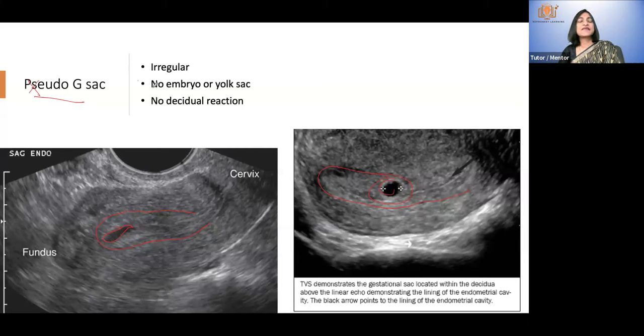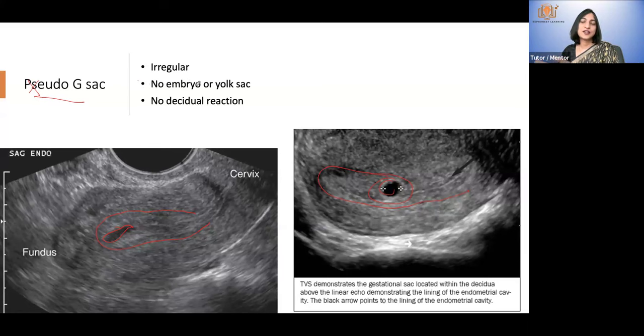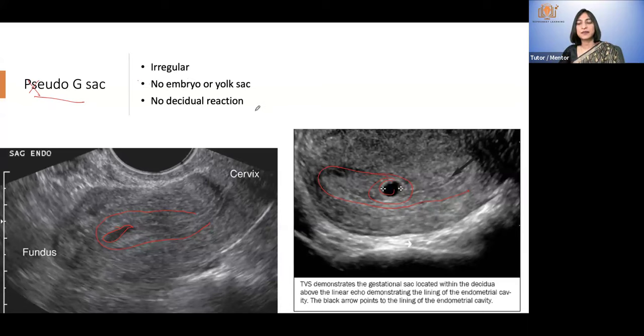If it is doubtful, call her one week later and the picture will be more clear. In a normal gestational sac, you will start seeing a yolk sac and embryo.